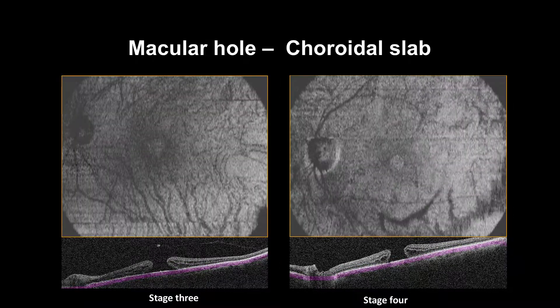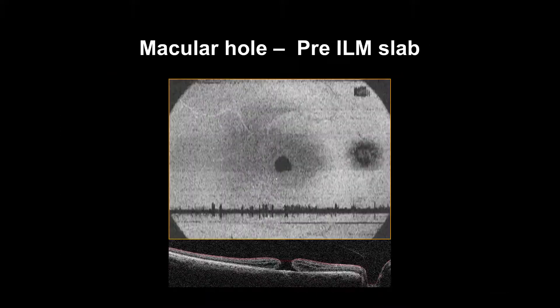The choroidal slab will show a projection artifact. EnFace OCT can be used to follow up patients with full thickness macular hole post-surgery, as it will show changes on both the ILM and IPL-INL slab that depict macular hole closure.